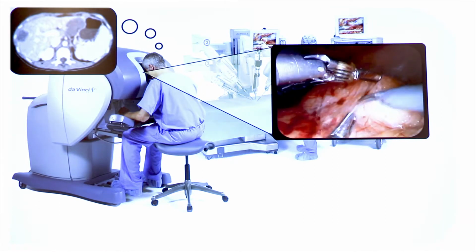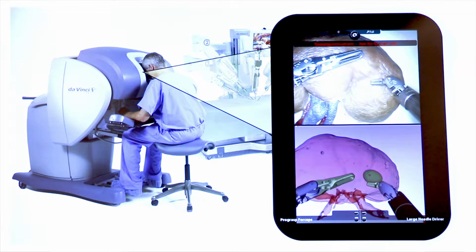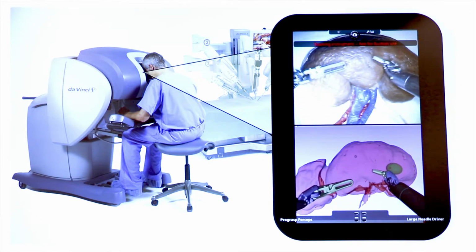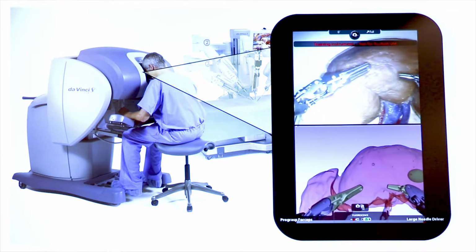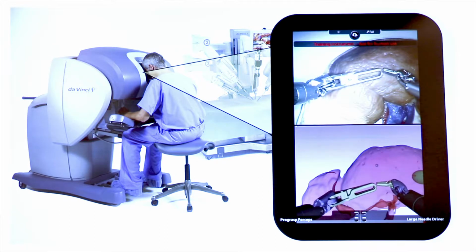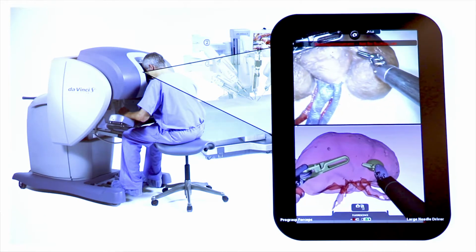So trying to move beyond this mental co-registration, our system aims to create an image guidance system that provides real-time visualization of both the anatomy and the robotic instruments, and also allows surgeons to see the subsurface features and other critical features in their actual surgical scene.